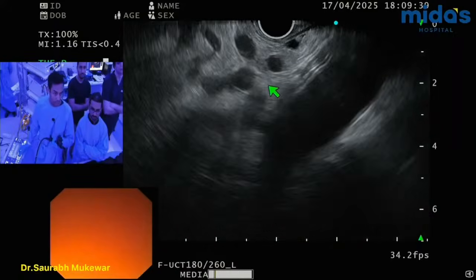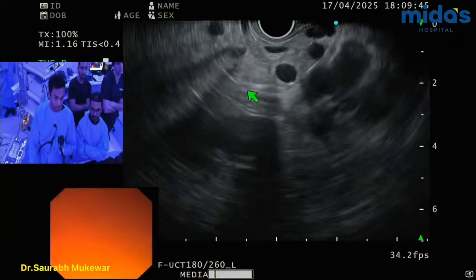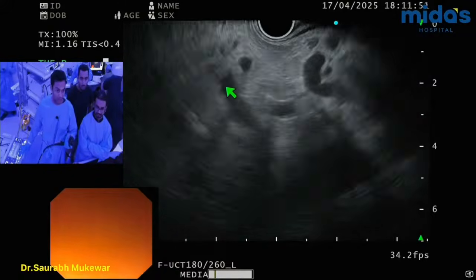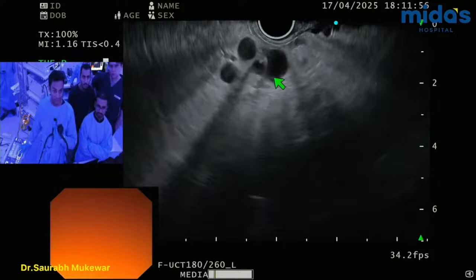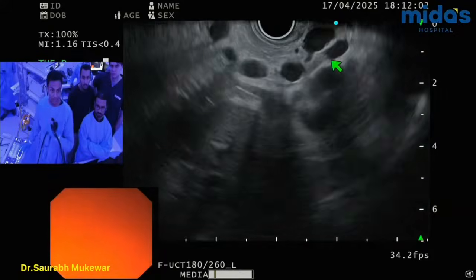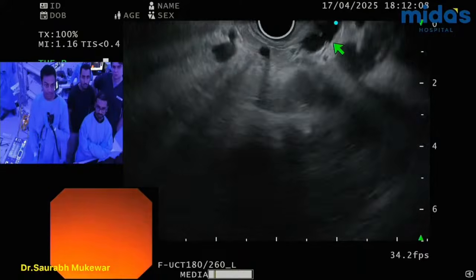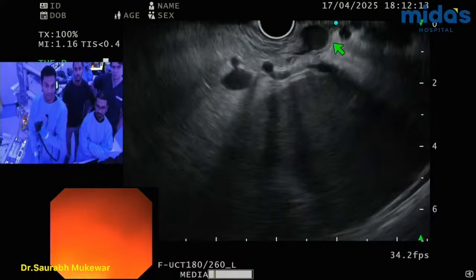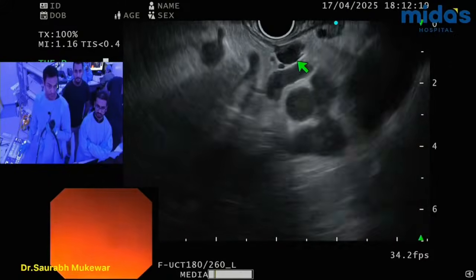Again, trace it to the splenic hilum first. This is the liver, this is the portal vein, and then you can see this is the branch coming off from here, and then as you trace this going up here, and then it goes down, right there, and then through this here, then you follow this here, it goes up here, and coming from right there is the penetration into the varix, right? So this one here is the penetrator, which I'm going to be concerned about.